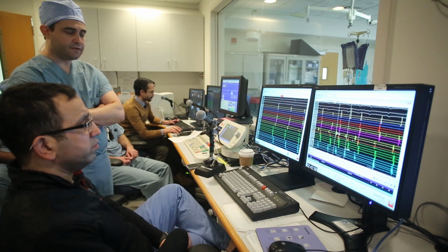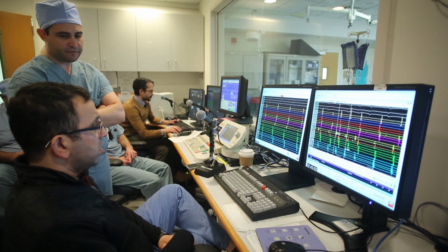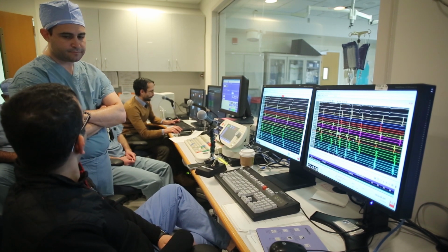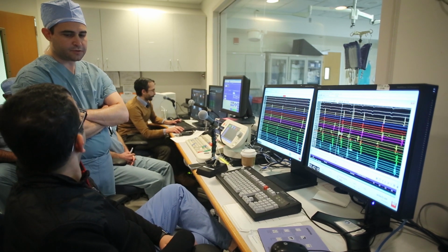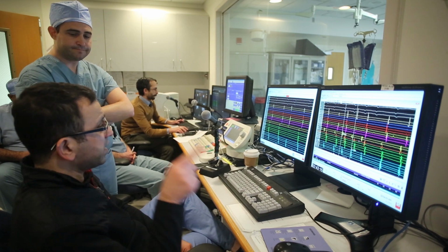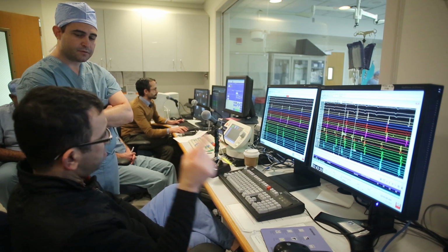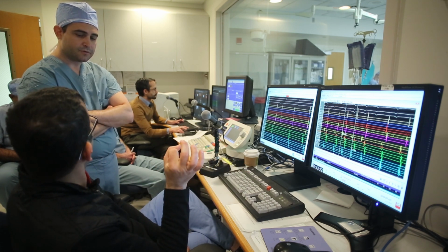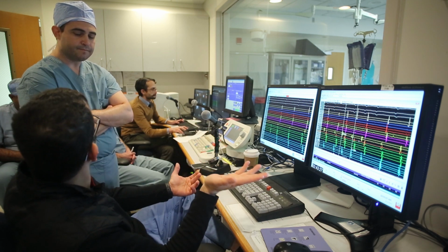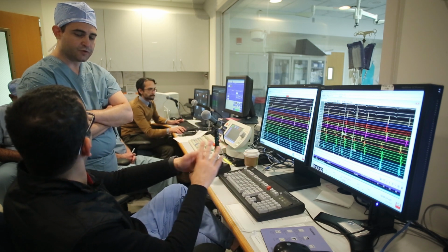And then when you're outside the veins and you're ablating, how big of a target are you looking at to ablate? Probably a diameter of like 2 centimeters or so. Okay. And then I repeat. So just like a little cluster. Yeah. And then repeat it and make sure it's gone. Actually, I'll make the ablation during AF after it's induced. Okay. With the medication, make a few lesions around this diameter. Sure. Shock again, because I know that reproducibly I'm going to get AF from the same location, and the end point would be that now you don't have any more AF.